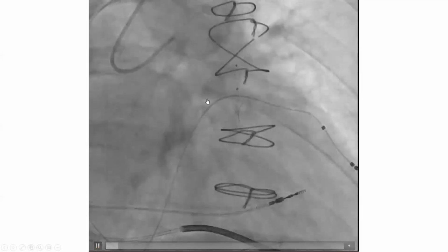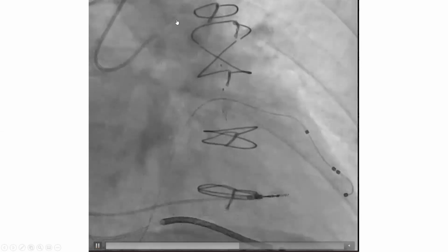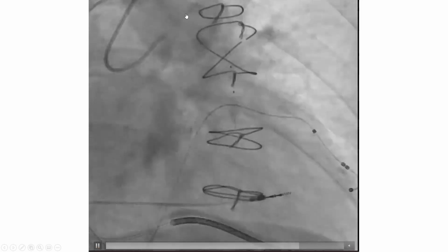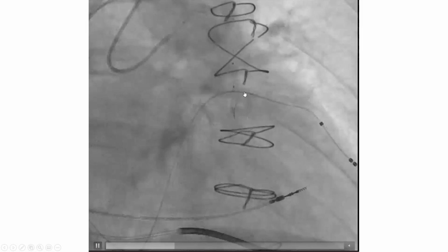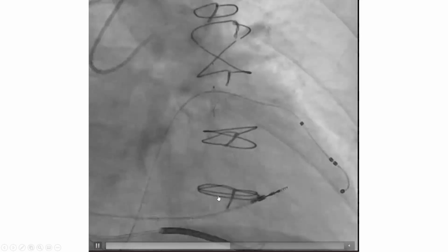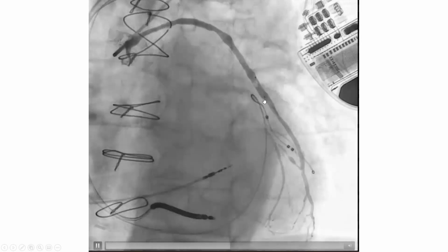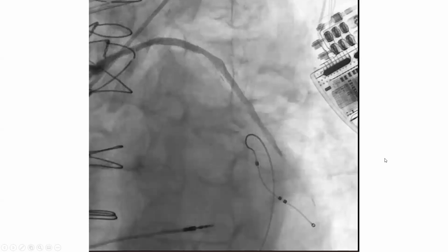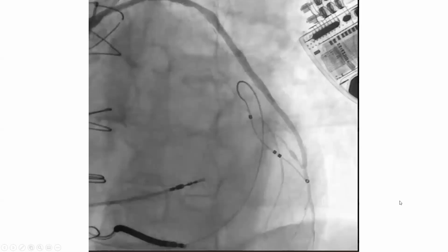It was a bit difficult to retrieve the filter, and you can see here, look at the retrieval catheter getting stuck in the stent here. We had to advance a buddy wire to retrieve the Spider basket, but nonetheless, that was a useful Spider, and it prevented the embolization of that big piece of atheroma. And we removed it with partial basket collapse. And this is the result after filter removal.